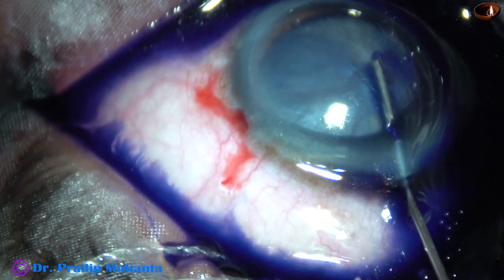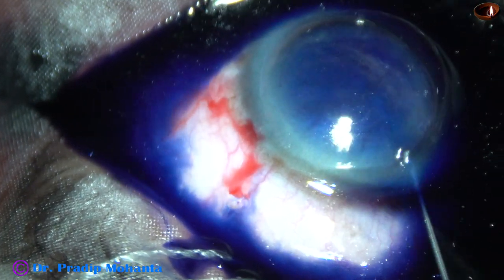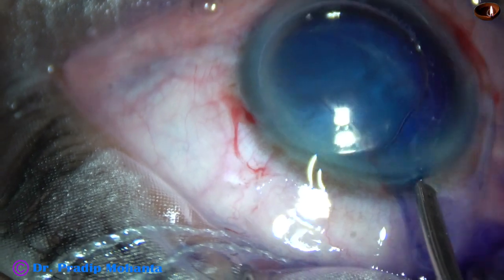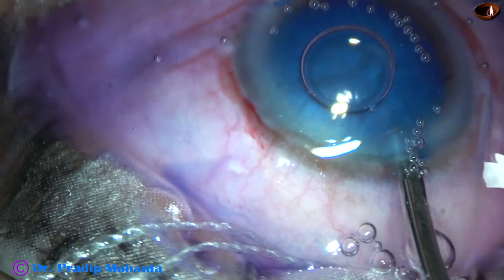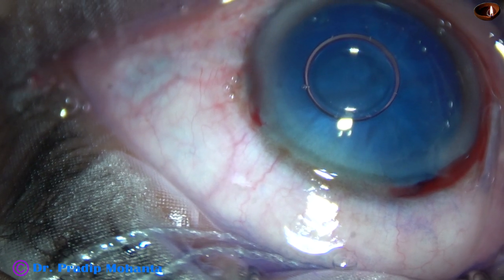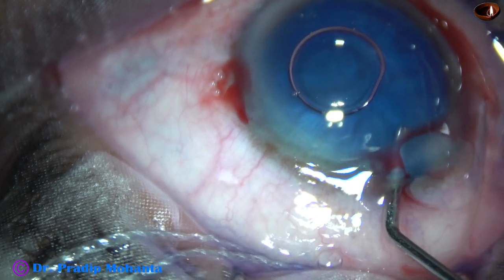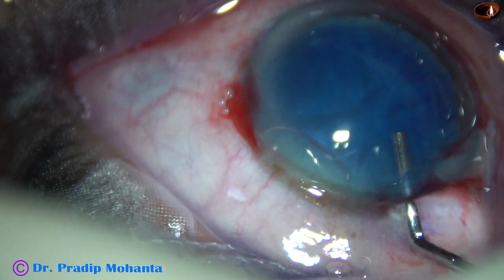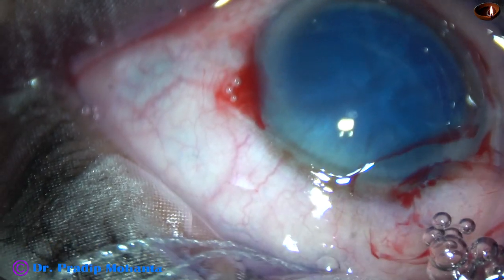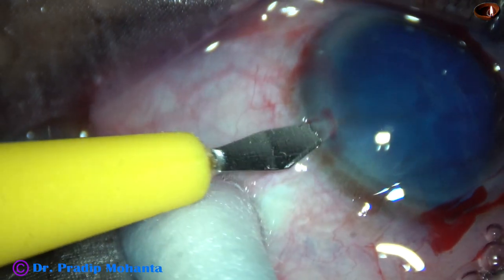I have applied a superior rectus bridle suture because I may need to convert to SICS. I have stained the capsule with trypan blue dye. Then the dye is washed out with BSS. The anterior chamber is then filled up with 2% hydroxypropylmethylcellulose. The anterior chamber is also very shallow. And now, the side ports — this is a side port on the left side of the main incision.